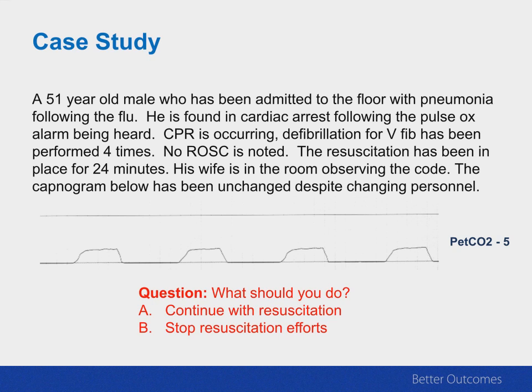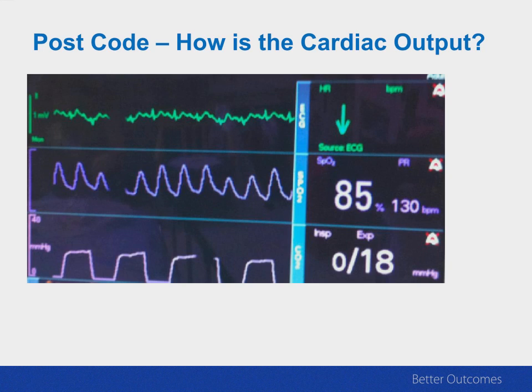The effort has been going on for over 20 minutes, and again, the wife's in the room. Take a look at the end tidal reading. It's reading 5. So the question for you is, what should you do? Well, physiologically, you should stop the resuscitation efforts. Obviously, with the wife in the room, you want to make sure she understands what's occurring. The whole point is that the end tidal is what's driving this.